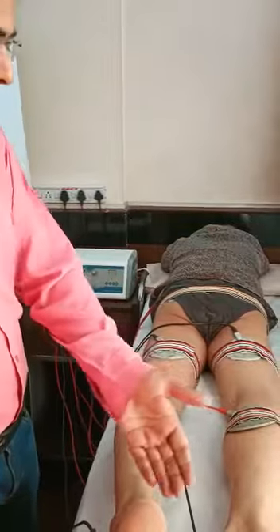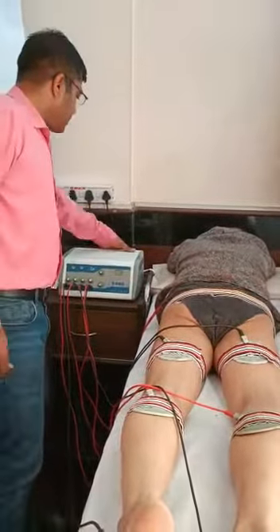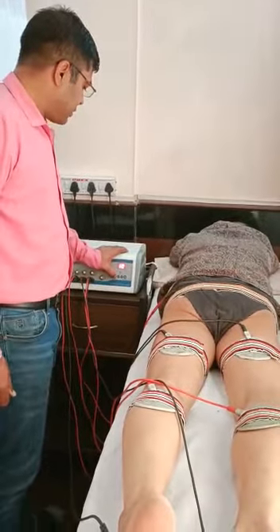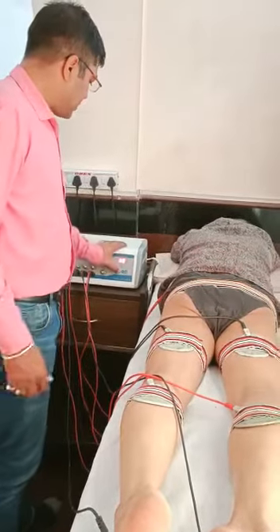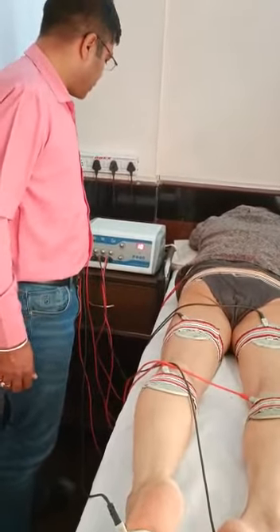The electrodes are placed along the course of the sciatic nerve. He is having bilateral sciatica. So what we are going to do now is we will switch on the machine and increase the time duration for the desired time. Then we will increase the intensity gently after switching on.